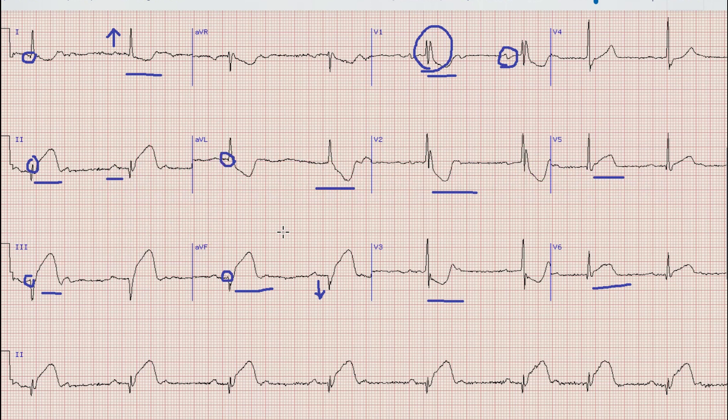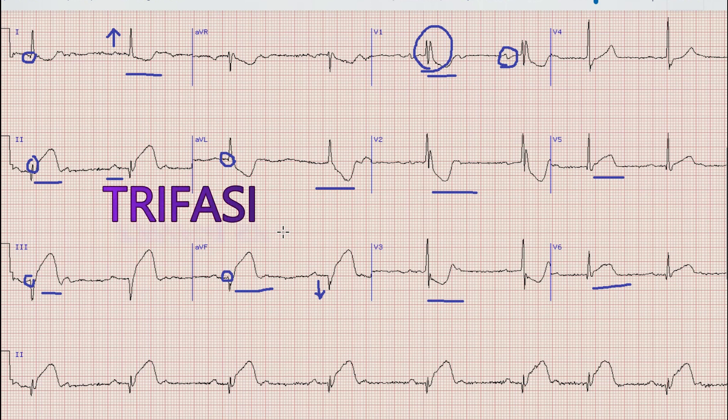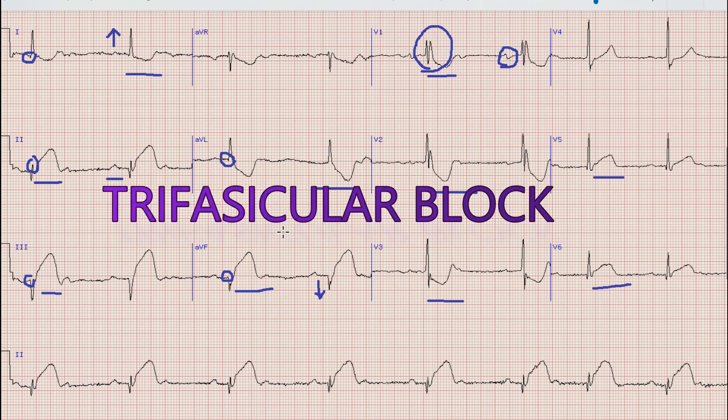So an ECG with AV nodal block which is variable, right bundle branch block, and left anterior fascicular block — if all three of them are present on the ECG — it means that there is trifascicular block.